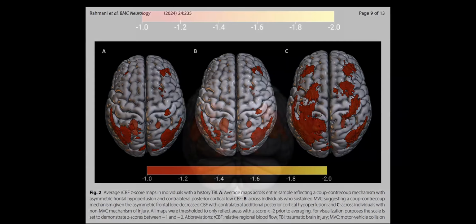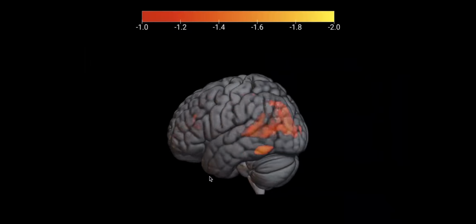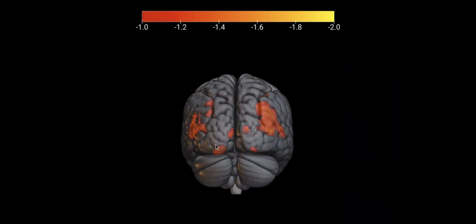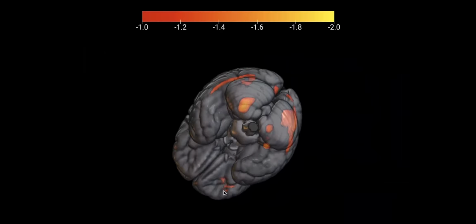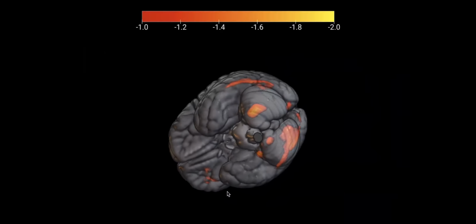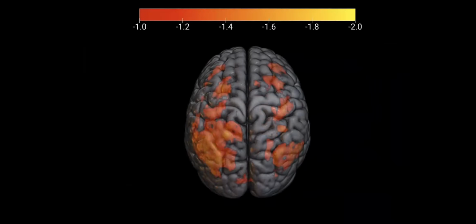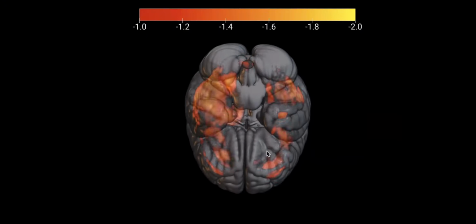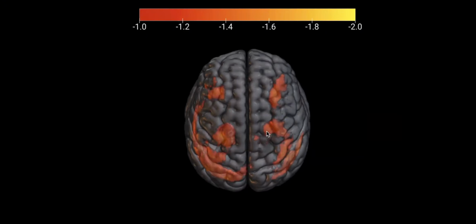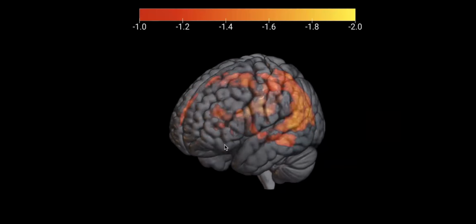Obviously, we can see abnormally low blood flow with ASL, regardless of the mechanism of TBI, but the patterns do differ. And again, we can see an example of these 3D maps showing the abnormality in terms of the entire cohort. We can see the asymmetry. We can see the Z-score maps projected onto the structural brain, shown in these abnormally low Z-scores. We can see the non-motor vehicle collision TBI more bilaterally symmetric in the presentation and abnormalities. And that's also quite insightful to see.